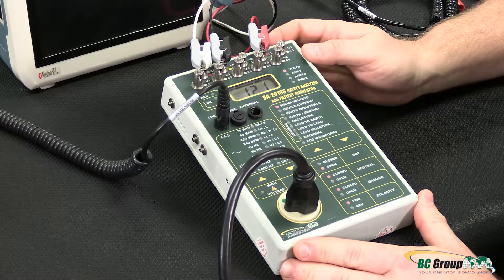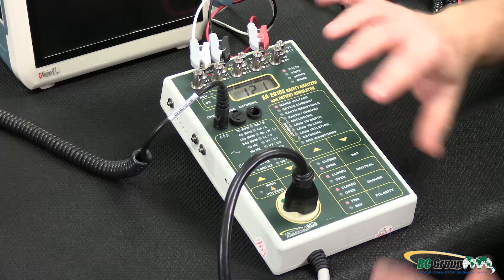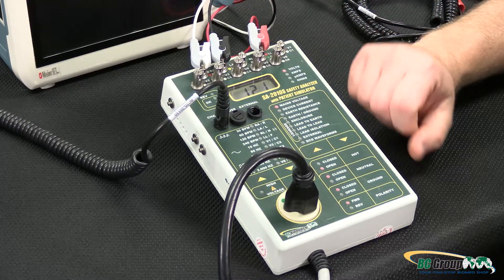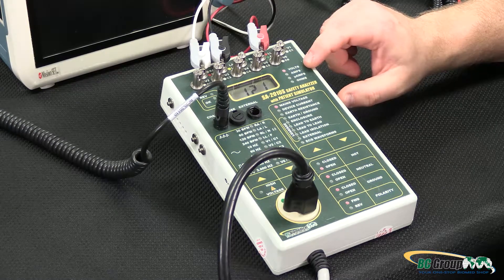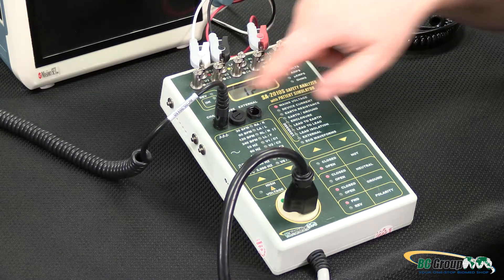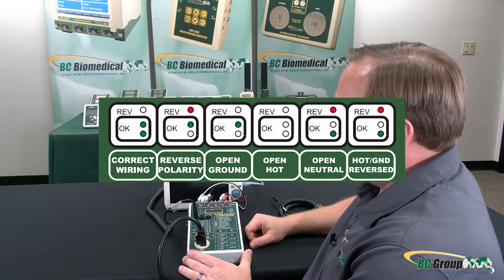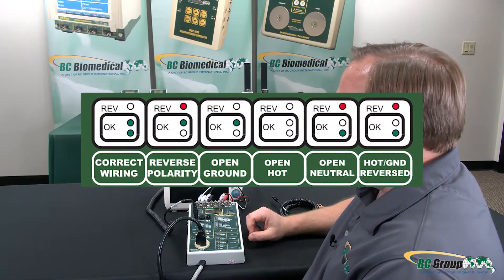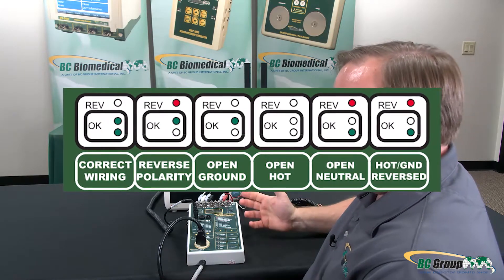When I first plug in the safety analyzer it will turn on and be in the main voltage mode. There's nothing to configure — I can just take my line voltage measurement directly off the safety analyzer display. Up here it shows which units the measurement is displayed in, and on this side I have a receptacle test indicator. The back label explains what each LED means, and this tells me that the outlet I'm plugged into is wired correctly.